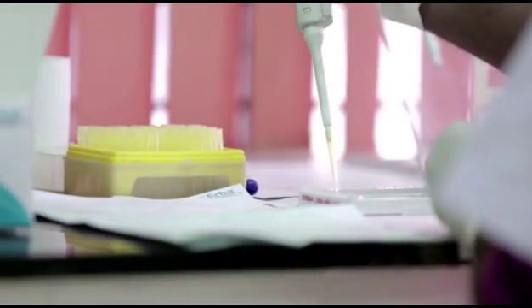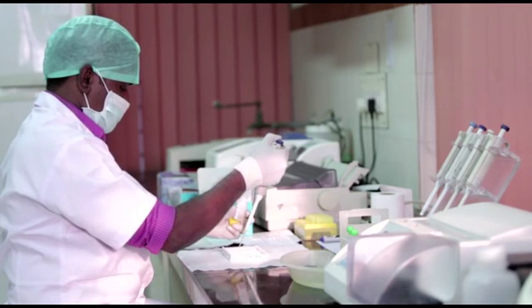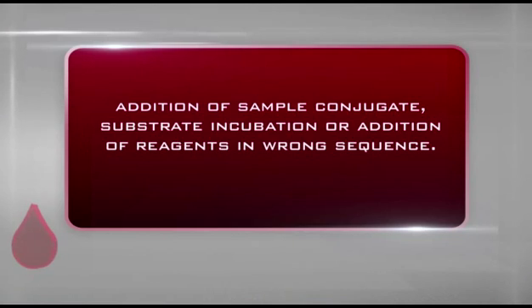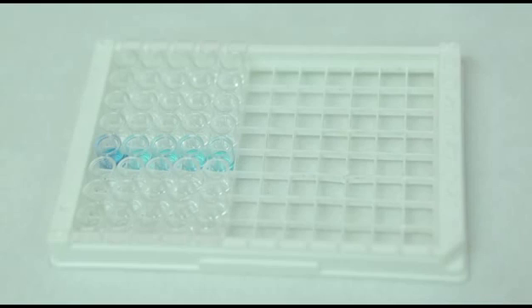Similarly, if there is no color development, check for the following. Have any steps been missed out or skipped, such as addition of sample conjugate, substrate incubation, or addition of reagents in the wrong sequence? An outdated microplate or reagent, or using a contaminated stopping solution.